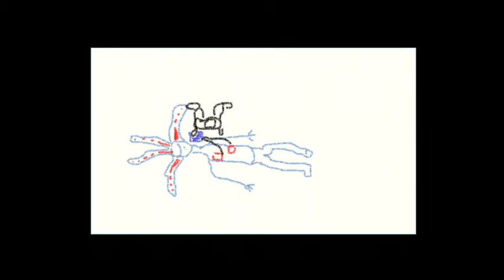But the Jedi do have a problem. They have a head appendage issue. I can be totally clear, thinking I'm ready to go, but I'm accidentally touching a tentacle and inadvertently shocking myself. So before you hit that button, make sure you are clear and everyone else is clear.